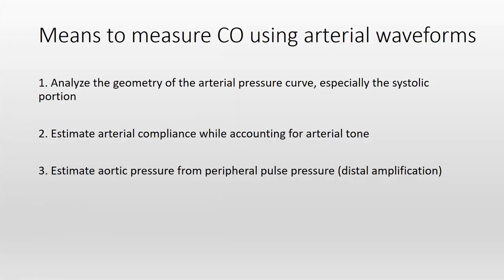Okay, so we use the arterial line now to give us values of cardiac output.